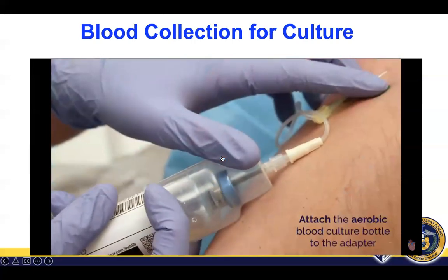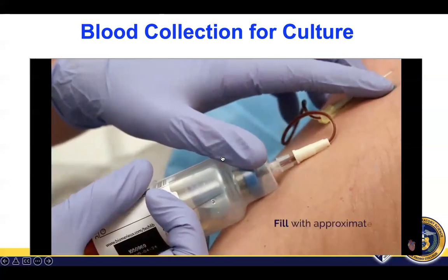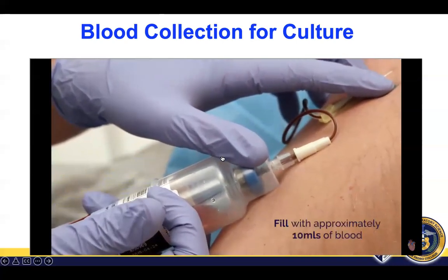So that's the butterfly method. It's also a closed system.